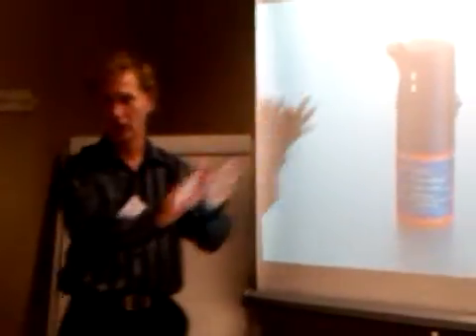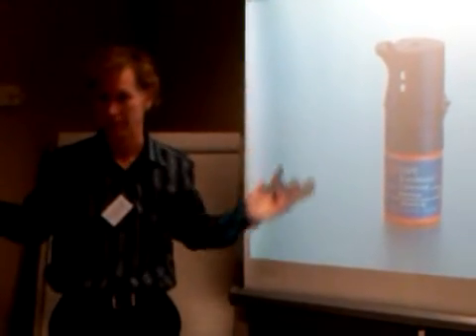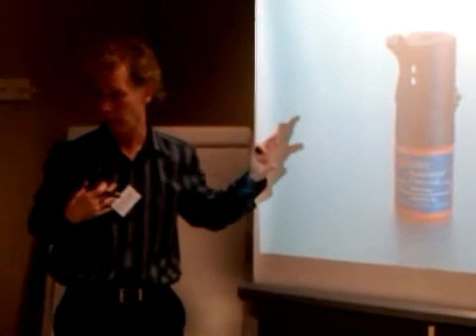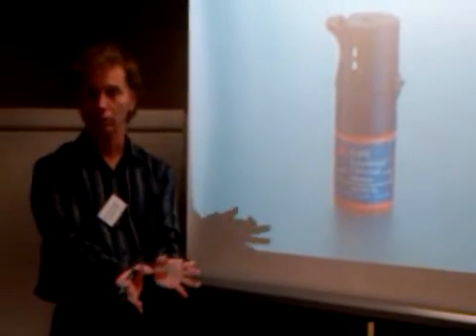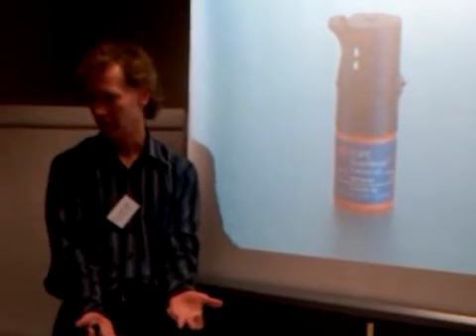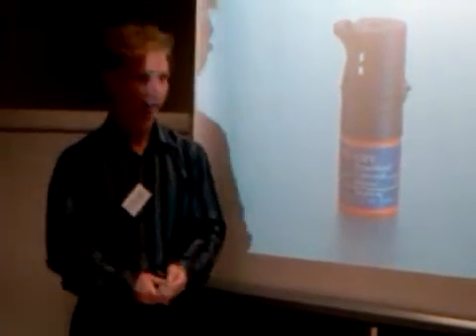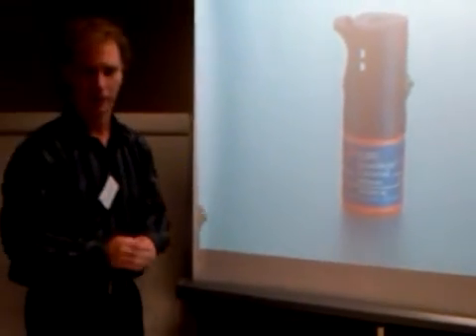The great thing about this is if you get etch on the dentin, which I do most of the time because I like to do a total etch, some of the self-etching resins have a very poor bond if you splash etch on the dentin. Many of the self-etching resins say don't etch the dentin. How are you going to etch the enamel? I don't want to worry about that. It's fast, and it's a little less expensive than some of the other resins. I don't know why, but the cost is a little less.